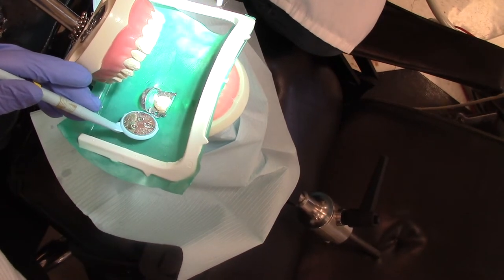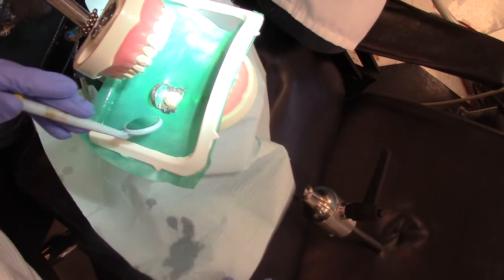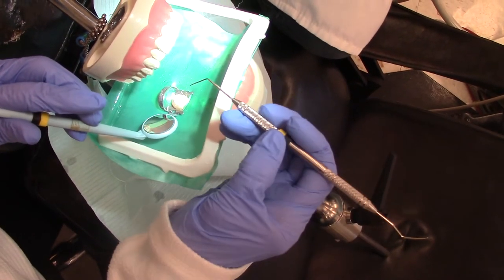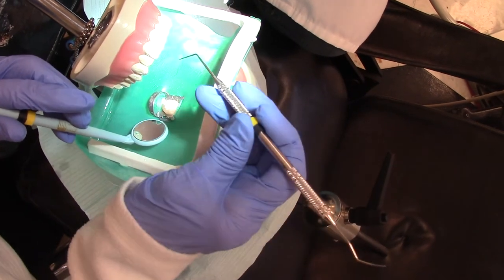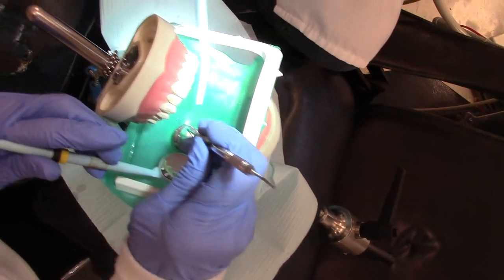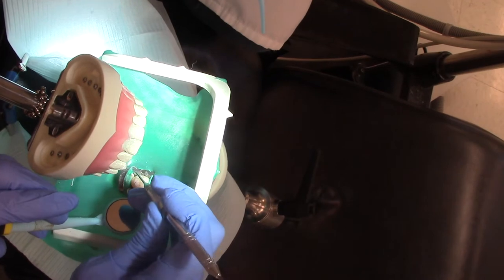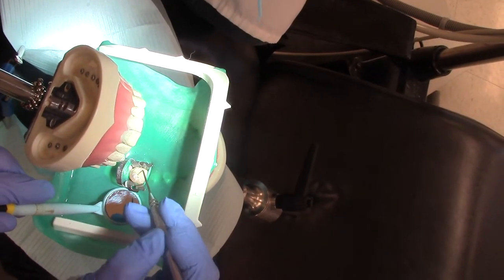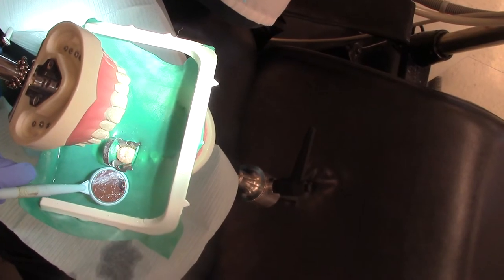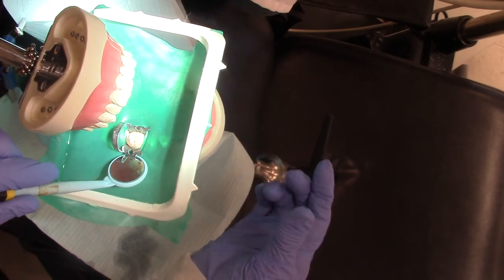We would have a much bigger hole, but because this is a denser material it's a little bit harder to drill through. The first thing we're going to do is use our endo explorer. Remember, our endo explorer has two ends on it and we're going to put it down inside the tooth to make sure we can get into each canal. This is tooth number 31, which would have three canals.